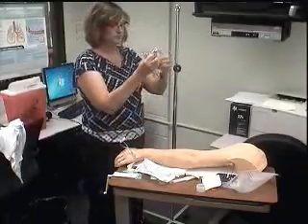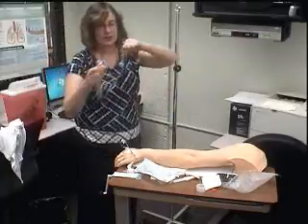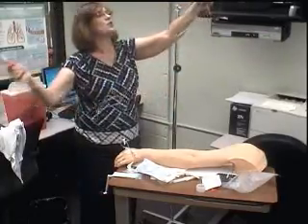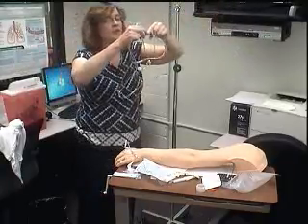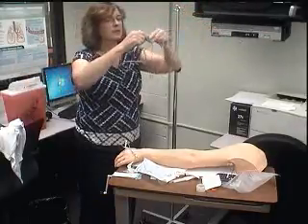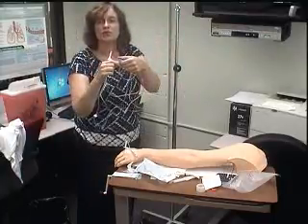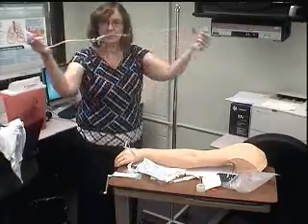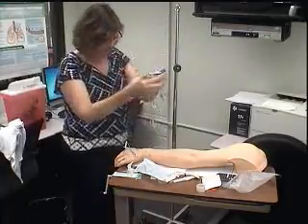So I've got my tubing. Whenever you open any kind of tubing, I don't know if you remember from last semester, I talked about NG tubes, the bags. Anything that comes is usually going to have the roller clamp open, and they do that to prevent it from causing damage to it. So I'm going to take the roller clamp and adjust it to however I want it, and first thing first, I'm going to shut the roller clamp. Please do that, because you will forget and you'll have a big mess everywhere. So close the roller clamp as such. The roller clamp goes down, you can tell it's closed because it won't move.